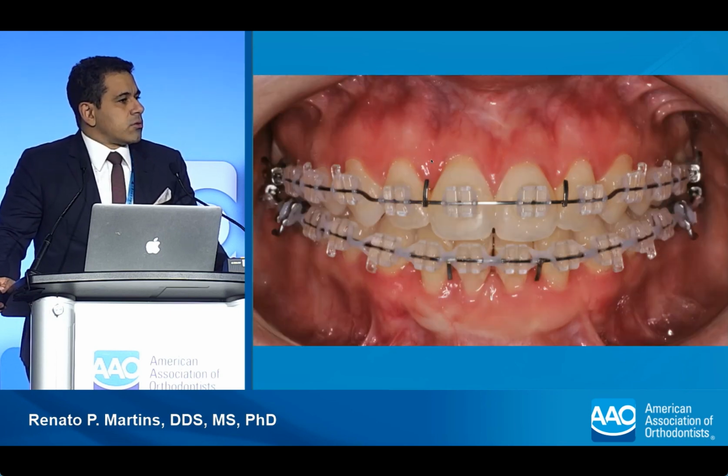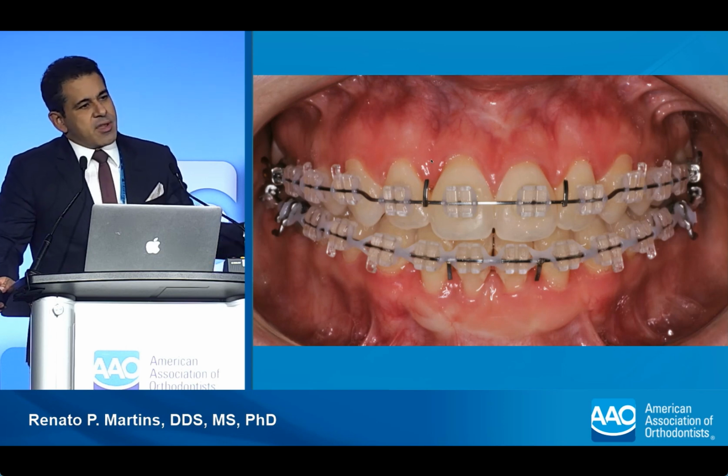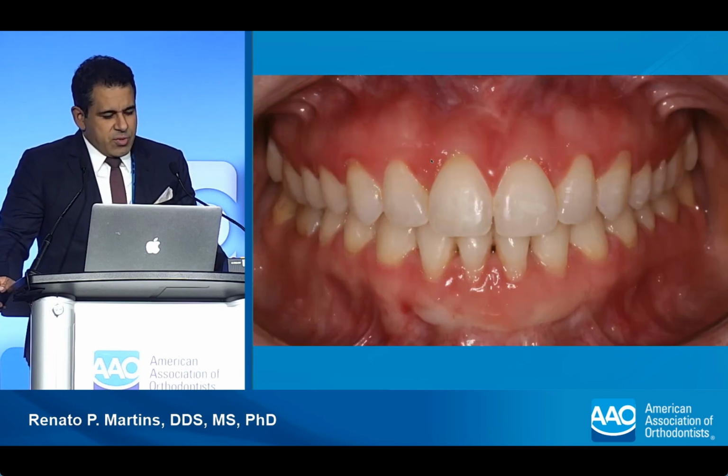And this is 4. And she came 4 months afterwards to the office and she said, well, can I put the aligners now? I said, yeah. So I took everything out. But there was not much to do. In 3 months, she was done.